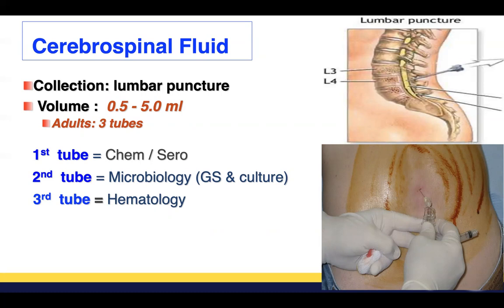Okay, but if the sample is scanty, you'll have to preserve that volume for microbial culture. If you have more, you can perform chemical tests, serological tests, and hematological tests as well. Okay.